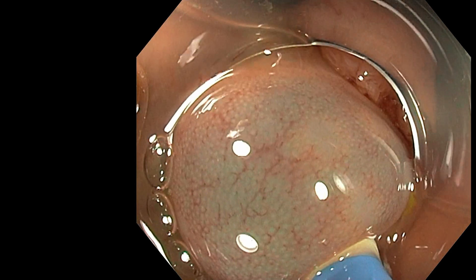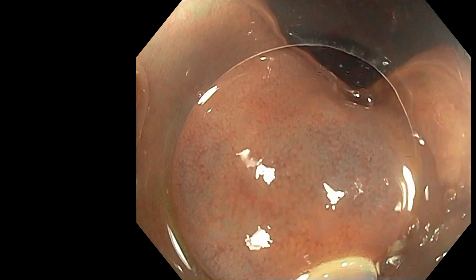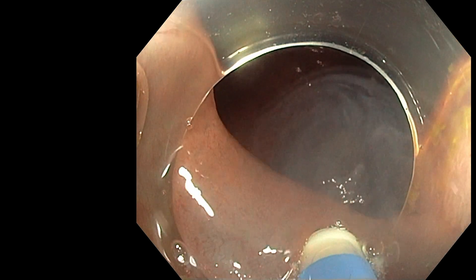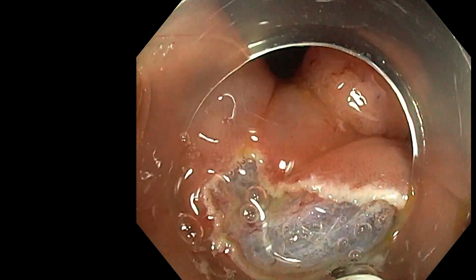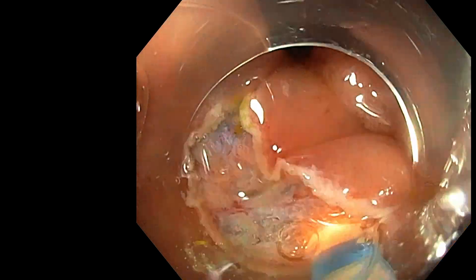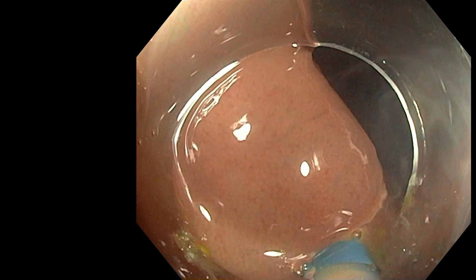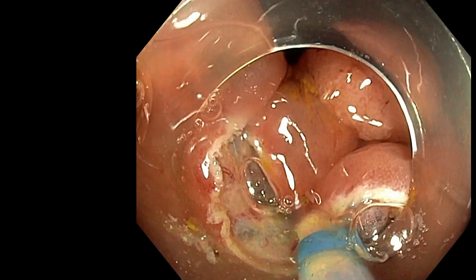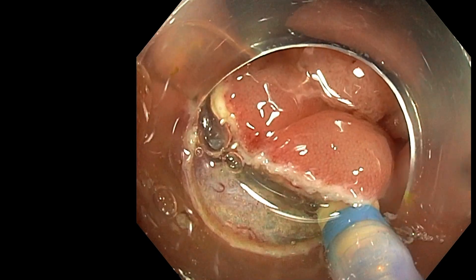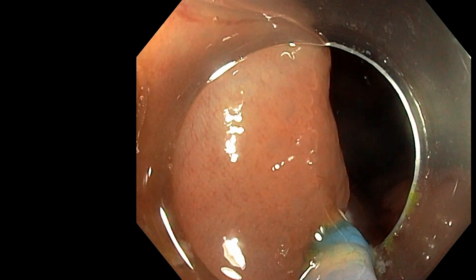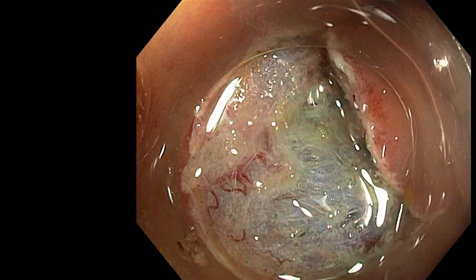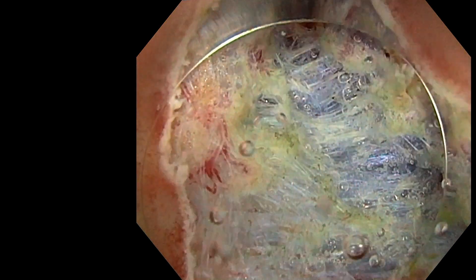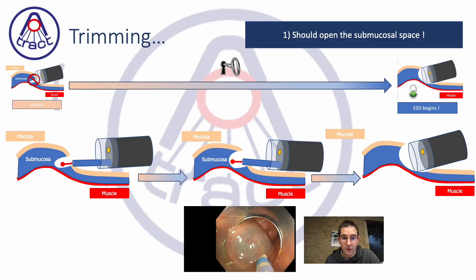The first step is always the incision, which you try to do in a smile shape — because when it is round and open it will be easier to enter the submucosal area. After the incision you will notice it is very small; the space is very small. Somewhere you will see whitish fibers, which are remaining muscularis mucosa fibers. There you repeat a kind of under-mucosa incision just under your mucosa, changing the axis toward the lesion target to progressively open the space. This is the trimming — it makes it feasible to enter with your cap under the submucosa.